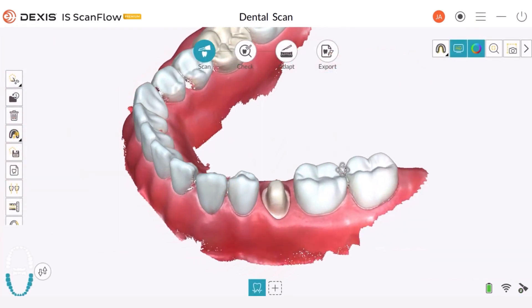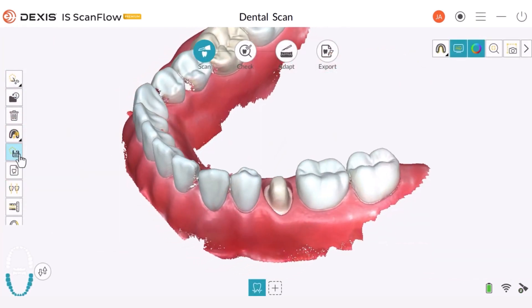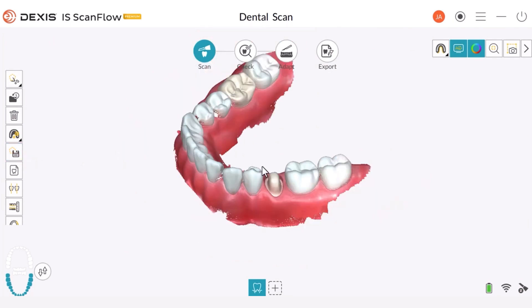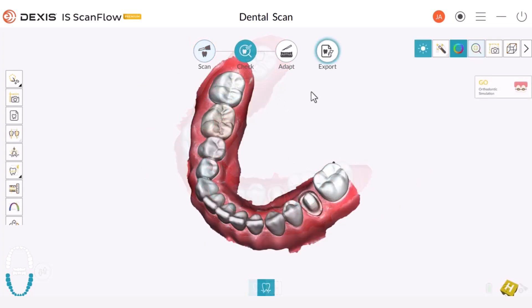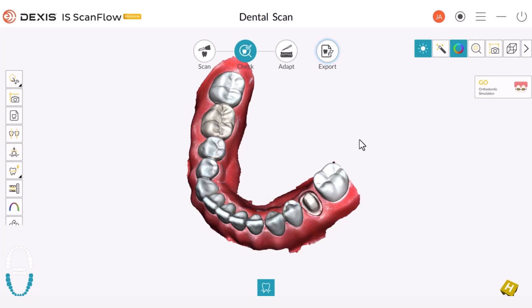Let's now explore the Keep button. This tool is useful in cases when you have a scan and the software has some difficulty connecting two edges of the scan together. In this example, we can see that the software removed the distal molar once we proceeded to the check step. In cases like this one, where the software didn't manage to connect two areas and removed data from your scan, you can go back from the check step to the scan step.